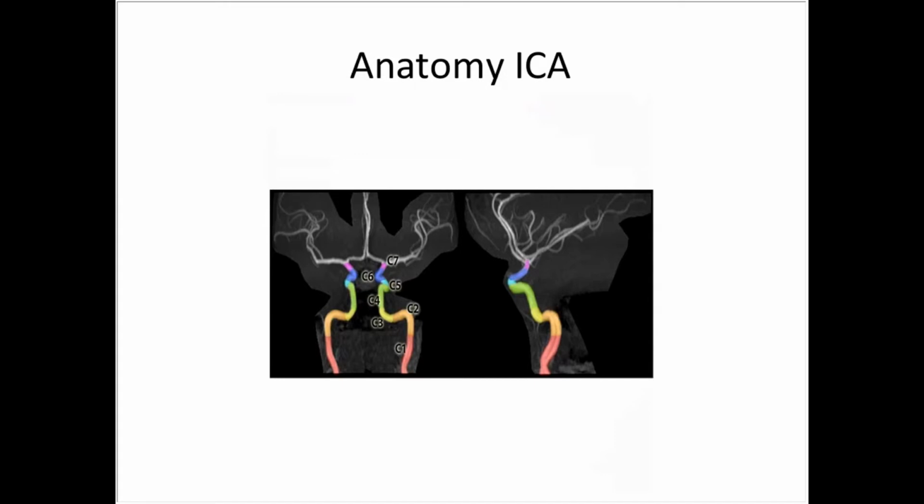Now, the internal carotid artery has multiple segments. The extracranial internal carotid is insonated through the submandibular approach. The petrous segment is where the ICA enters the skull. The petrous, the lacerum, the proximal cavernous, and mid-cavernous are not insonated by transcranial Doppler. Over the eye, we can insonate the distal cavernous, the clinoid, and the supraclinoid ICA.